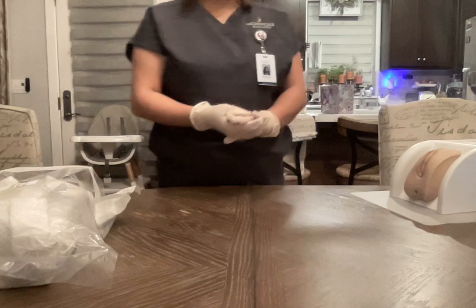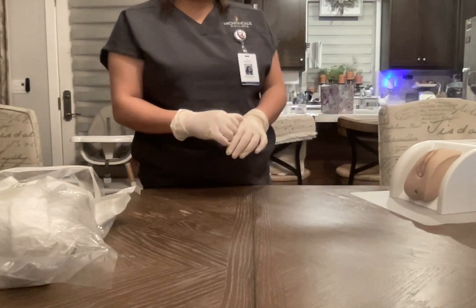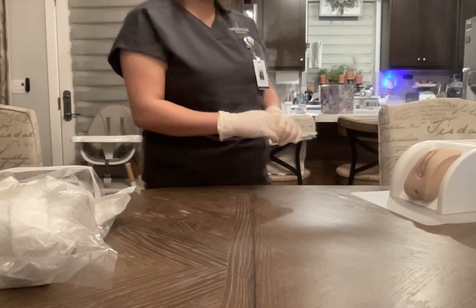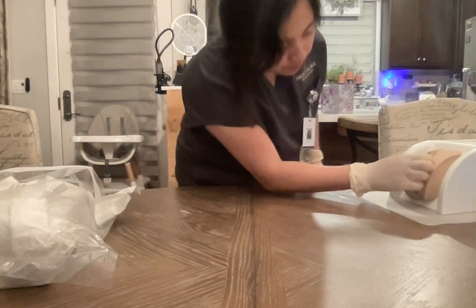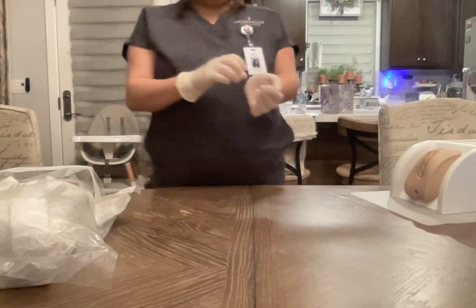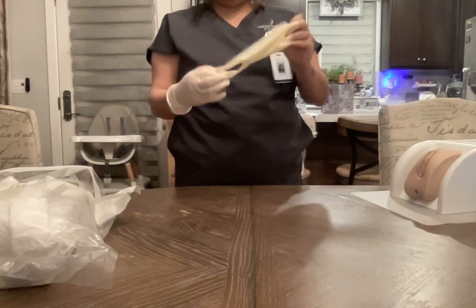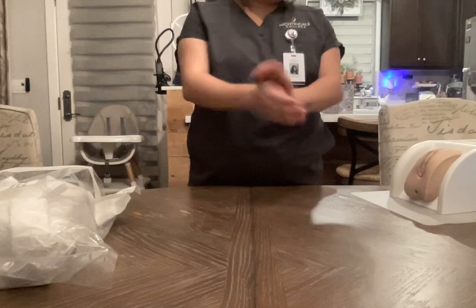Okay, so I'm going to check the patient's urinary meatus, see if I can see that opening, and also check for any discharge, discoloration, or any odor. Okay, I'm going to remove my gloves. Okay, perform hand hygiene.